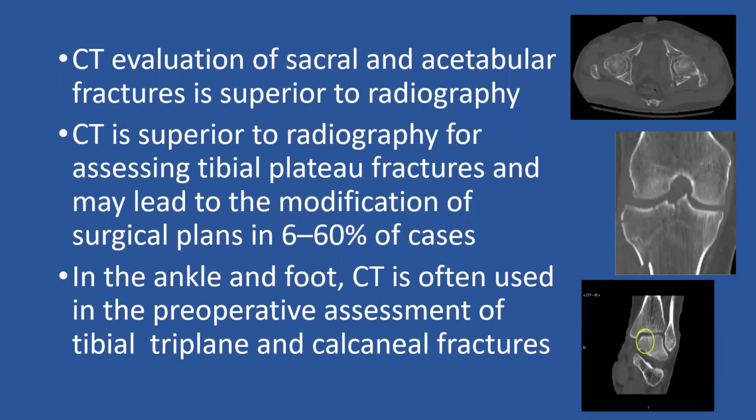CT evaluation of sacral and acetabular fractures. Gentlemen, I live on them. A CT tells us more about the anterior column, posterior column fractures, transverse fractures, loose fragments within the joint. I love CT scan, but I don't love the radiation caused by it. CT is superior to radiography for assessing tibial plateau fractures. I'm preparing a lecture to give in Egypt on the 3-column fractures. CT is the basis of my lecture. You have to know this.